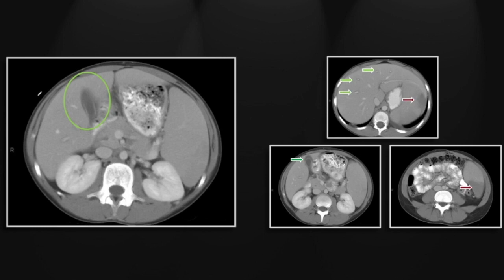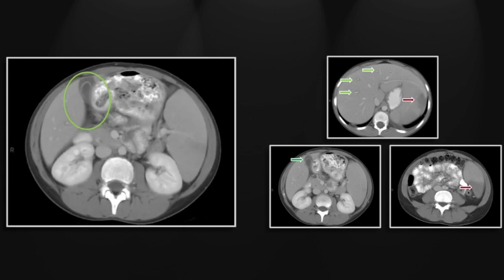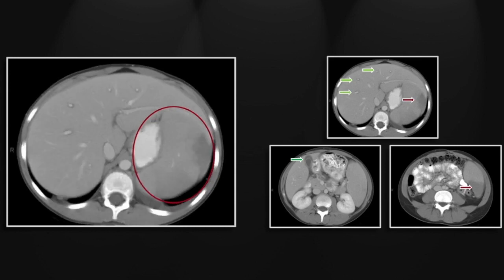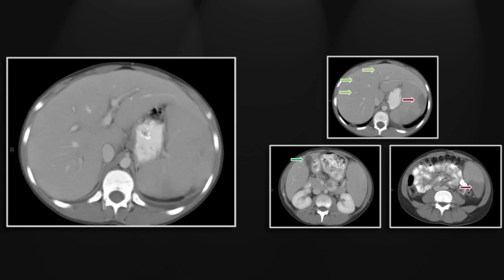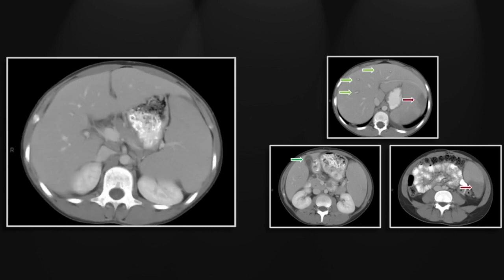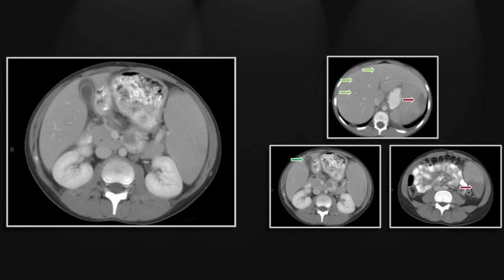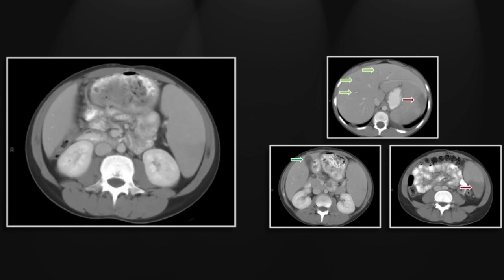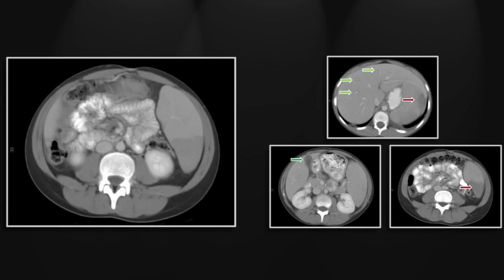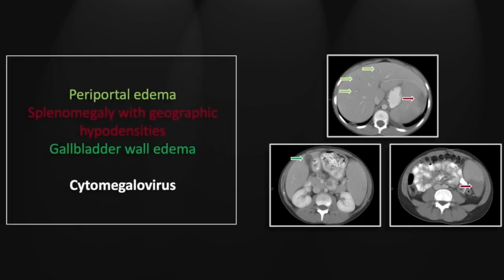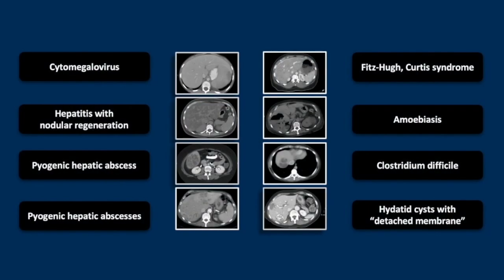On the cine, you can appreciate the extent of that gallbladder wall edema, and we get another look at the marked splenomegaly and the multifocal geographic hypodensities, both superiorly and inferiorly, denoting splenic infarcts. So that is a case of cytomegalovirus infection: periportal edema, gallbladder wall edema, splenomegaly, and associated infarcts.